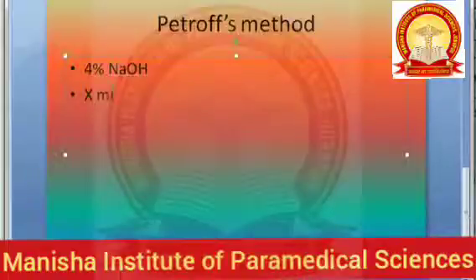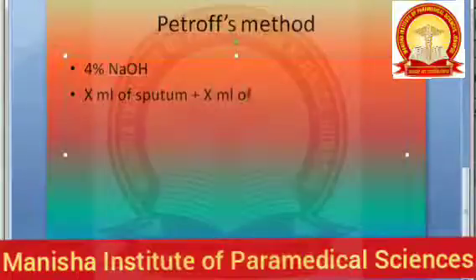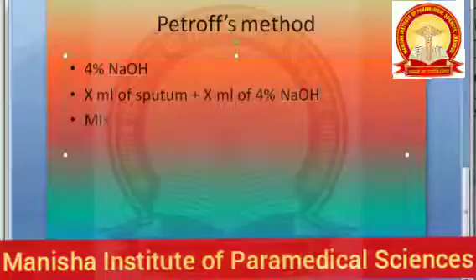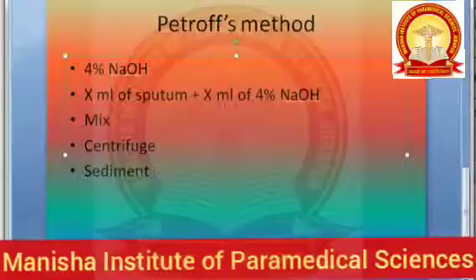So you will take X ml of sputum plus X ml of 4% NaOH, then mix thoroughly and centrifuge it. The sediment is neutralized.